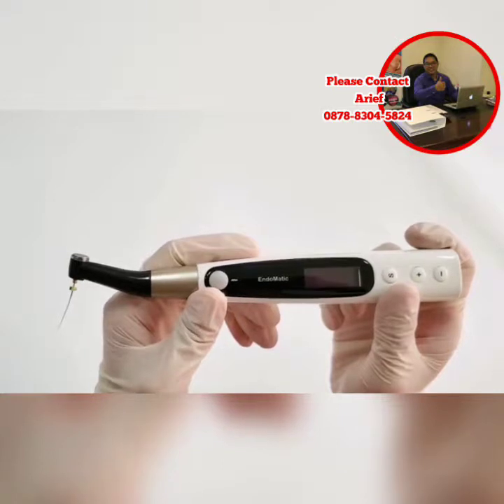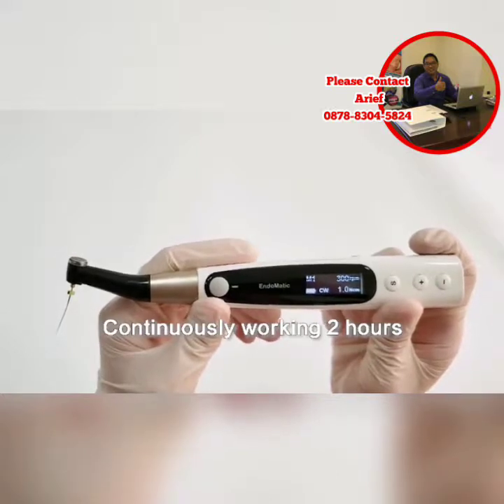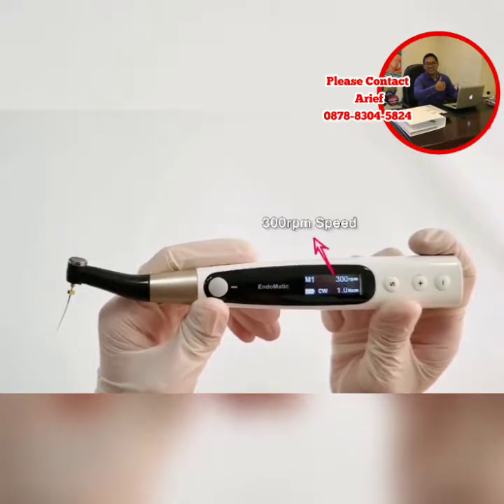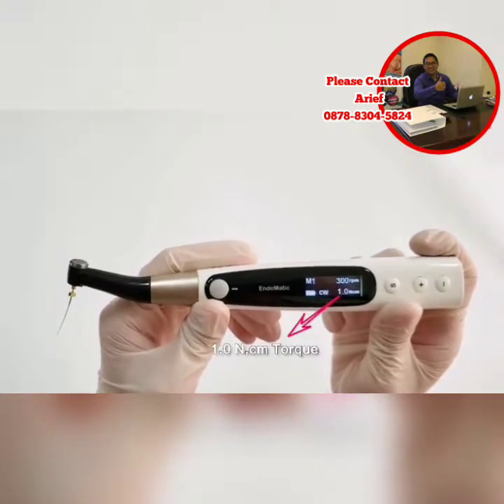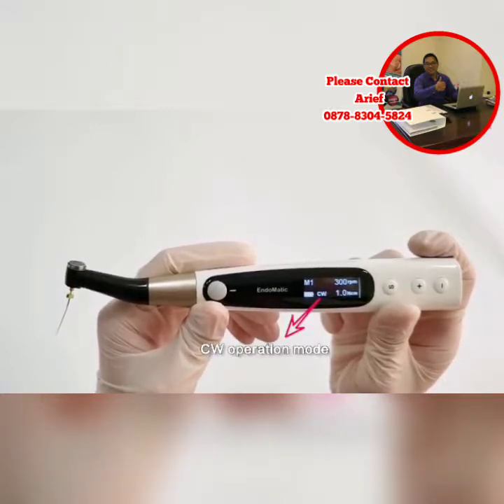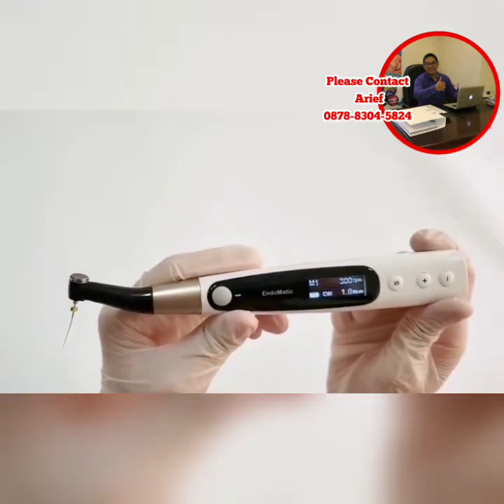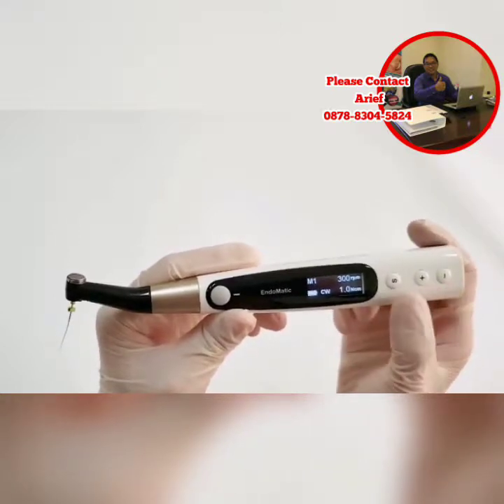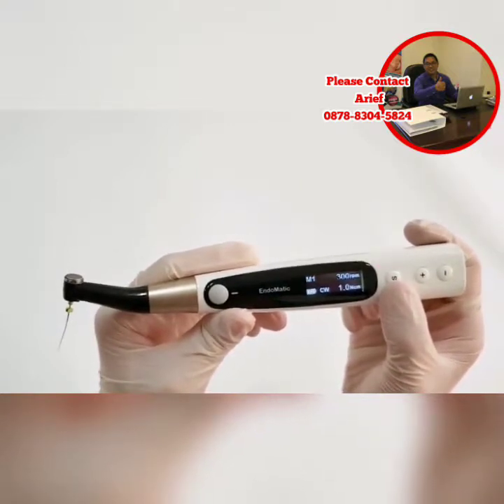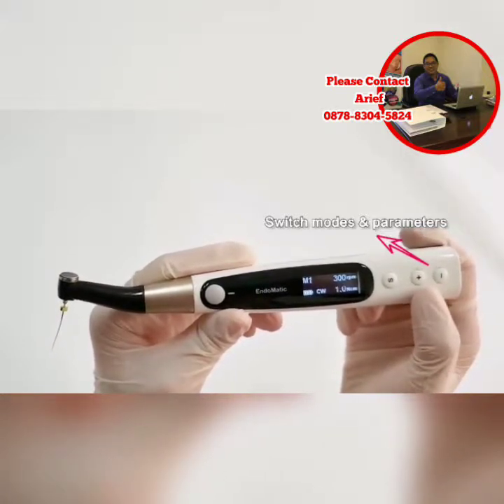For Endermatic, press the power button to start up the device. Please look at the screen — there are 5 display parameters: M1 stands for program, 300 rpm stands for speed, 1.0N stands for torque, CW stands for operation mode, and this icon shows the battery usage. We select different functions and parameters through these 3 buttons. Press the S button to select different functions, and press the plus and minus buttons to switch different modes and parameters.